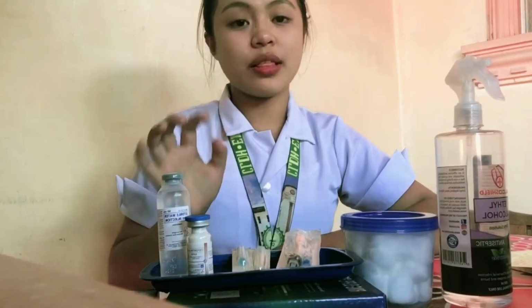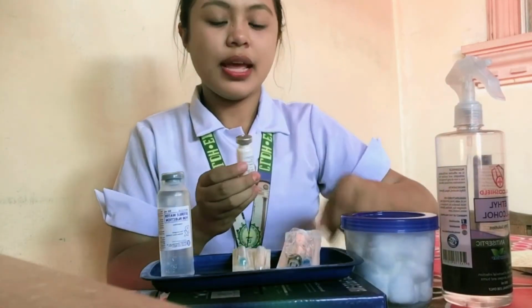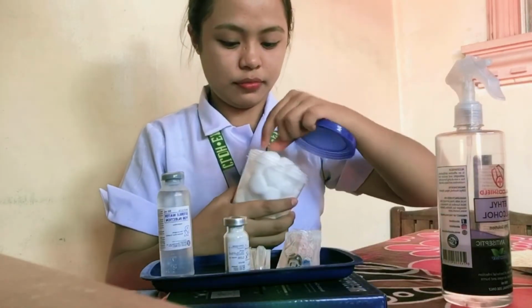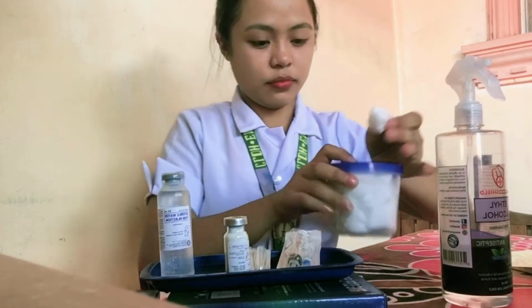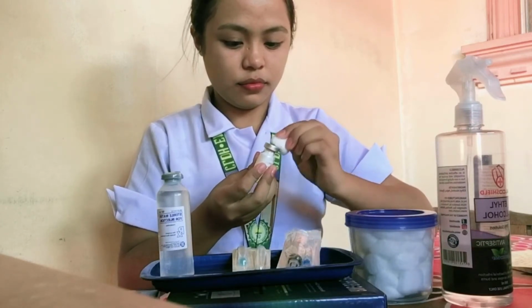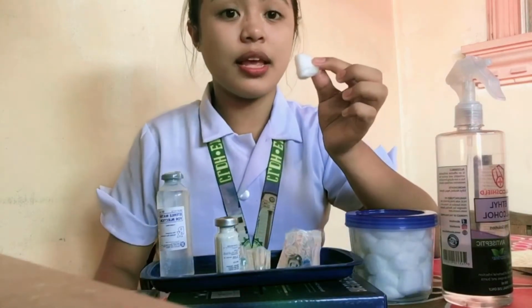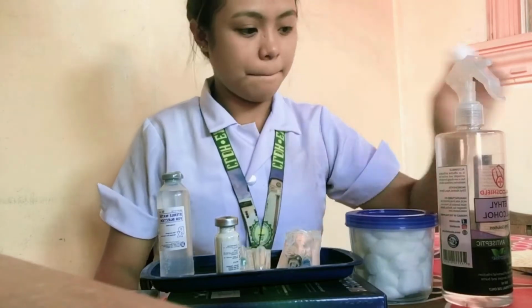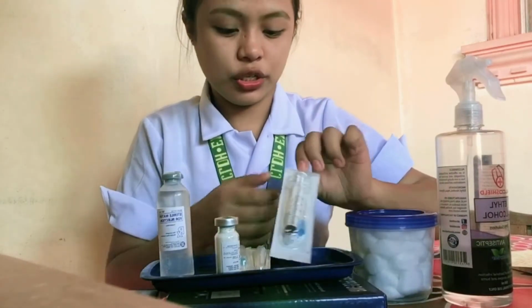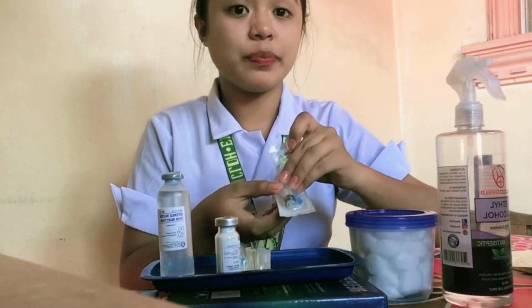Next, we need to get our vial and remove its cap carefully, and clean the top of the vial with a clean cotton. After cleaning our vial, we need to dispose of it in its right disposal. Next, we need to prepare our syringe. We need to remove its original needle and replace it with the aspirating needle.